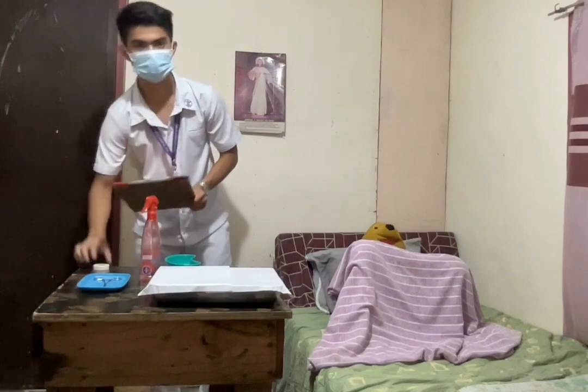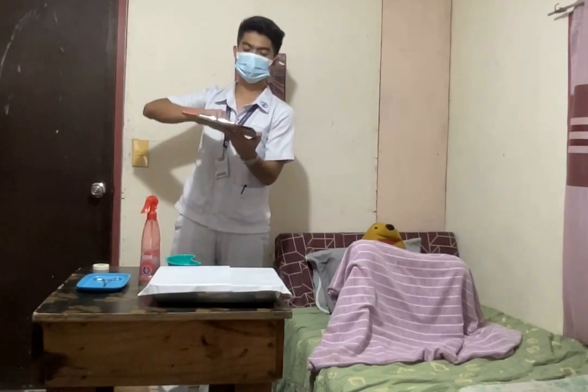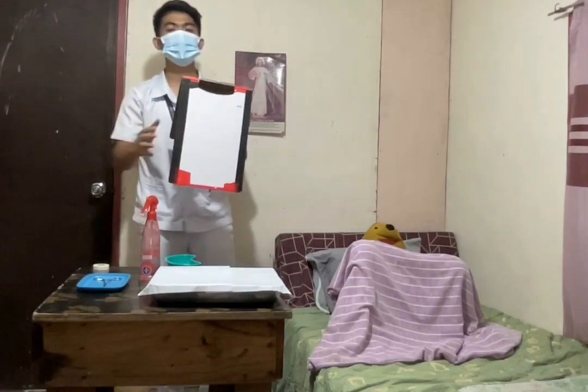Catheterization is a medical procedure involving the insertion of a thin, flexible tube called a catheter into a patient's body through a natural orifice or an incision. It is commonly used to access and treat various parts of the body such as the urinary bladder, blood vessels, or the heart. First, we're going to check the doctor's order for the catheterization. This is to ensure the procedure is authorized and necessary for the patient's care.